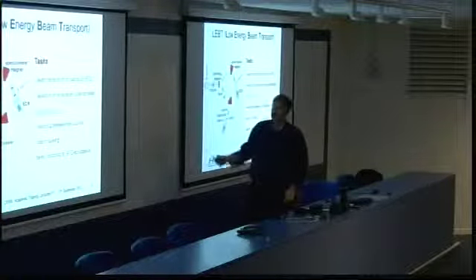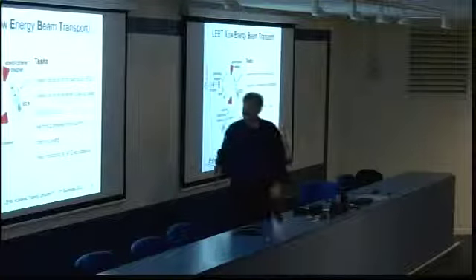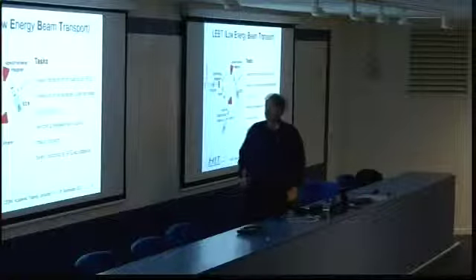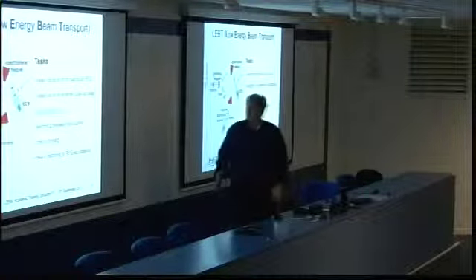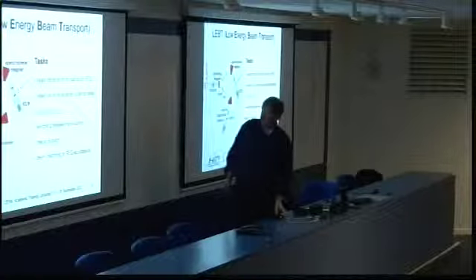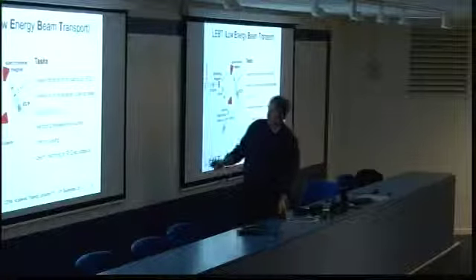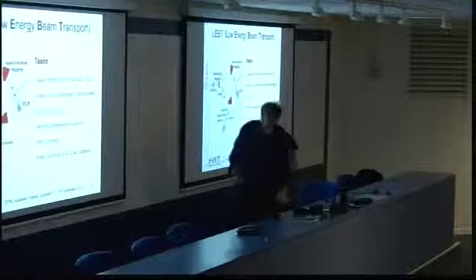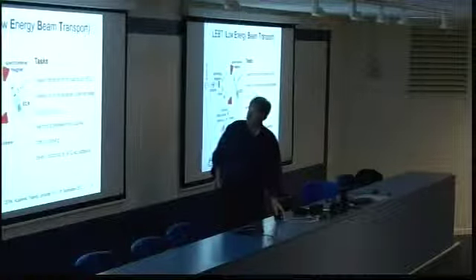So we waste 99% of the beam along this beam path, but nevertheless this is a stable configuration, and the ECR ion sources run very smoothly. Well, and the last point which the LEBT has to do is to match the beam to the RFQ acceptance.